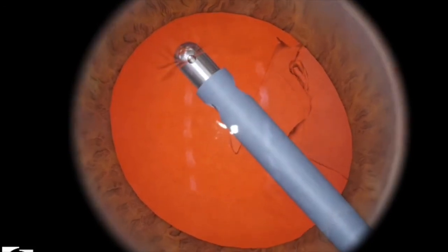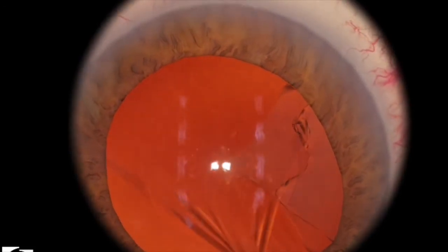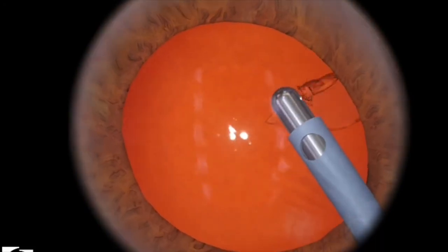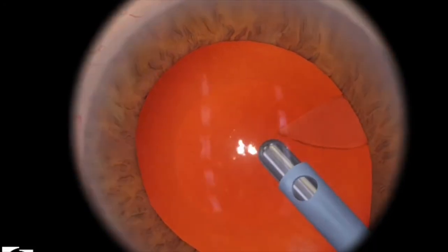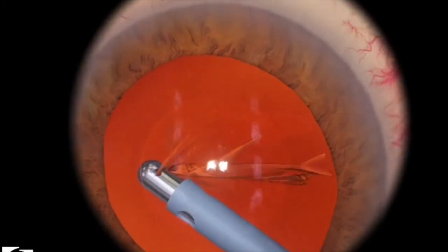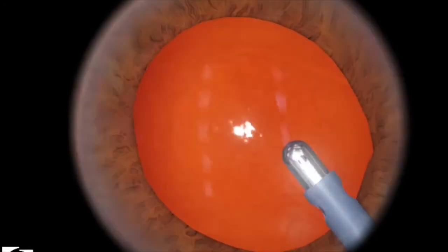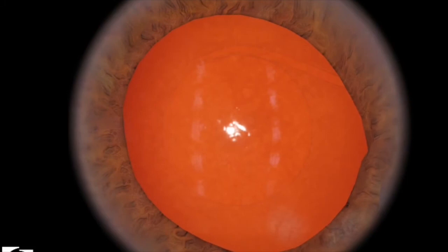Sometimes if you're not looking carefully, that can actually look like pieces of cortex that you want to engage. If you pull too much, you may cause a zonular rupture, or right there, a posterior capsule rupture. You can see that there's a rent in the back, right where the posterior capsule is.